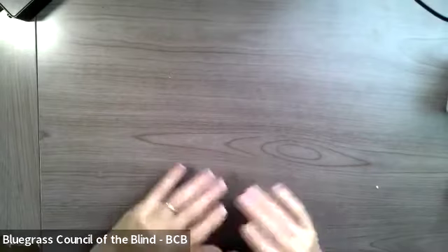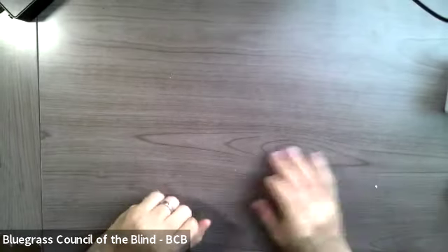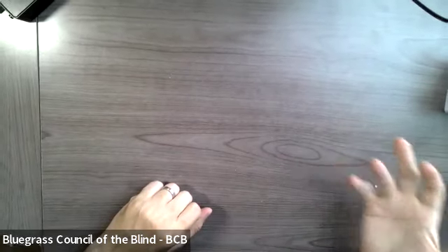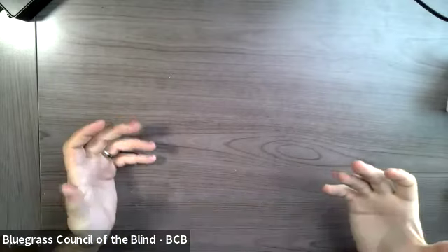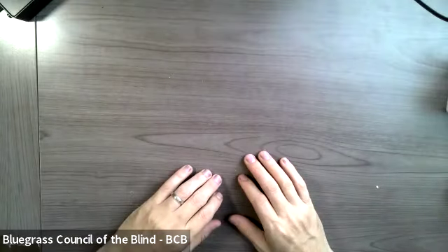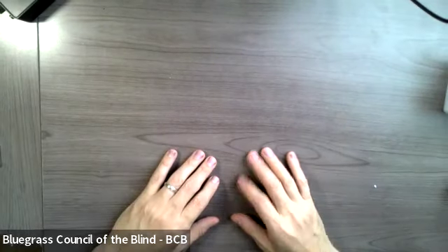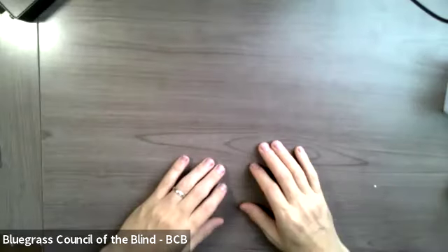The rigid cane does not fold up. It does not break at all. It's a solid cane shaft. And so some people prefer a rigid cane. Some people don't like to deal with it not being as portable. Getting in and out of cars, in and out of airplanes, in and out of trains and buses, it's a little bit more difficult to handle a rigid cane than it is a folding cane. And then once again, you have the telescopic cane that telescopes down nice and small.